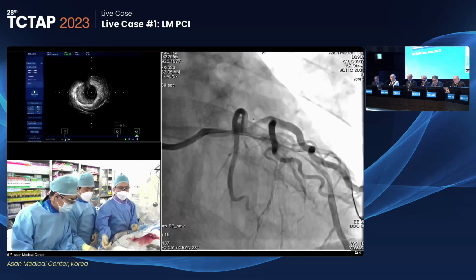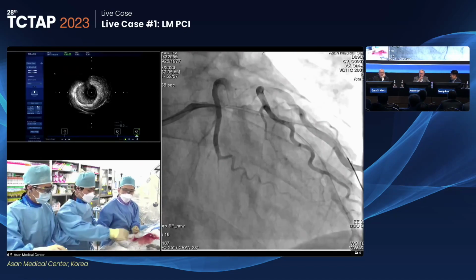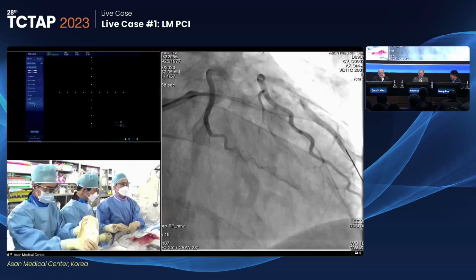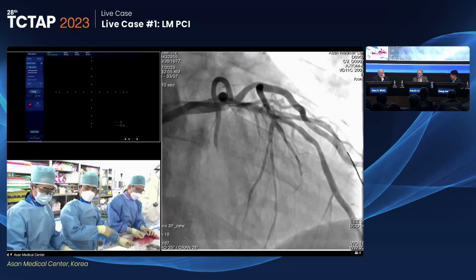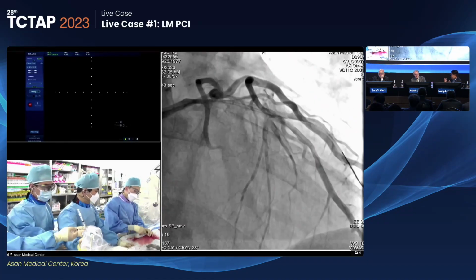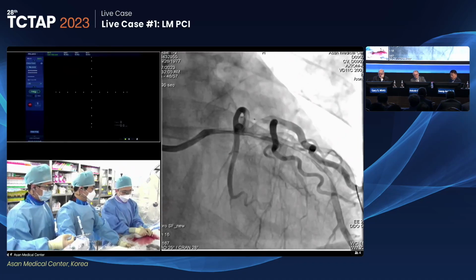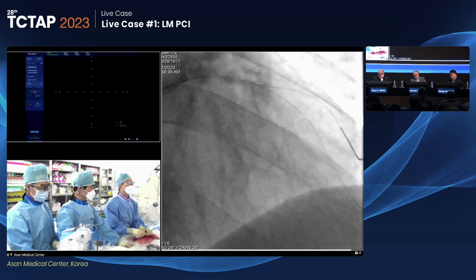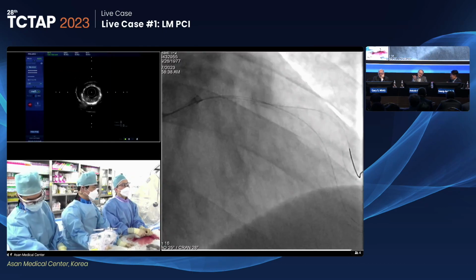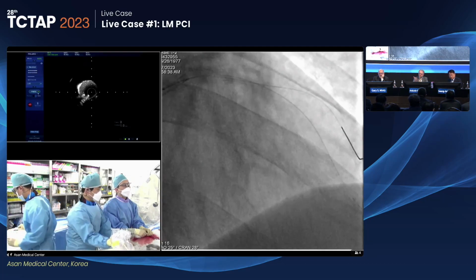Either. Well, I don't know. Anatomic, you mean the ischemia? There's no data that stenting is used to treat atherosclerosis. Sometimes we cannot discriminate, in terms of small discrepancy, between anatomic and ischemic concern, so I think if a 48 long stent would be okay, why not? But if it's not critical, now we have very good medical therapy for lesions.